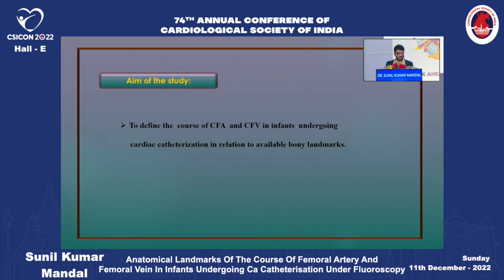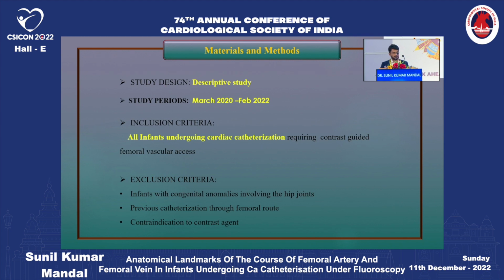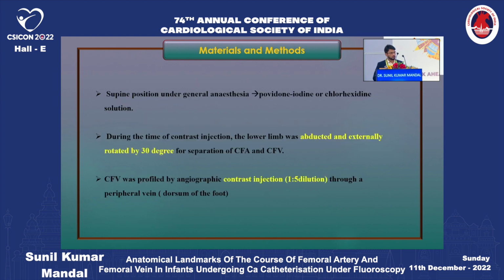So the aim of my study was to define the course of the femoral artery and common femoral vein in infants undergoing cardiac catheterization. It was a descriptive study from March 2020 to February 2022. We included all the infants undergoing cardiac catheterization requiring contrast-guided femoral vascular access. After putting the infants in supine position under general anesthesia, the local site was cleaned and the lower limb was abducted and externally rotated by 30 degrees for the separation of the common femoral artery and common femoral vein.